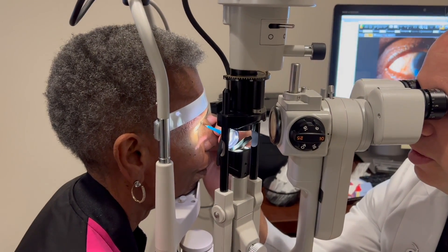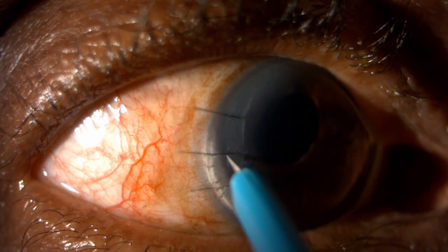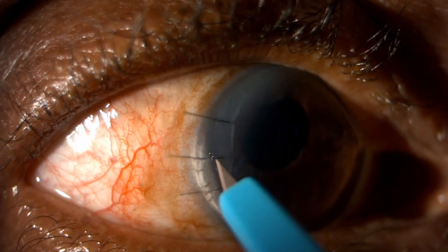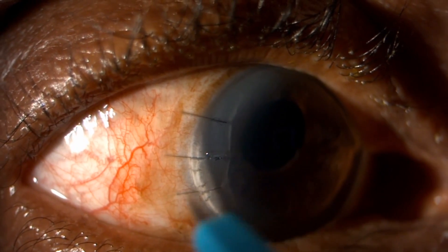Here we have a patient who needs a couple of interrupted sutures removed. I've got my sharp blade in hand. We're going to carefully go under the epithelium and just nick the suture until it gaps. The second step for removing this stitch is to take the dull side of the blade and flip the suture up and out of the epithelium, so it's sticking up like a tail and you can grab it with a jeweler's forcep. Now I'm using the dull side of the cutting blade to flip the suture up so it's sticking out of the epithelium.